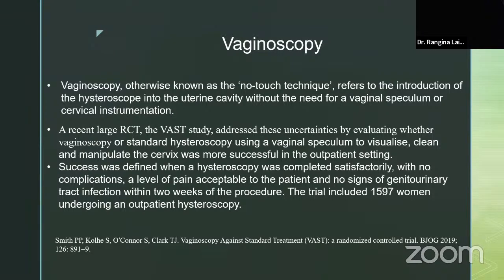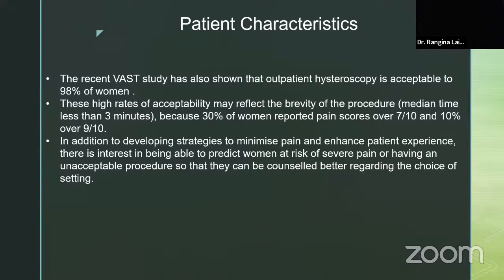Once upon a time when I started doing the procedure, one of my juniors told me there's nothing to be done in hysteroscopy. You just have to put a speculum, hold the cervix, and insert the scope. But I personally prefer not to use any speculum. It's a no-touch technique in my practice too.